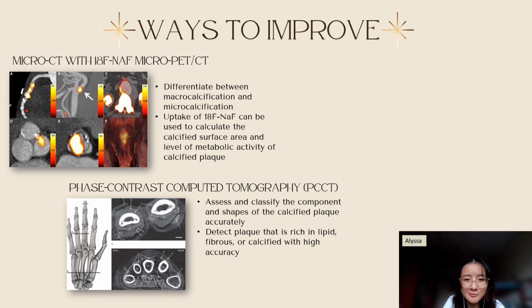Besides that, we can also use micro-CT with 18F-sodium fluoride micro-PET/CT because this method can differentiate between micro-calcification and macro-calcification. The uptake of 18F-sodium fluoride can be used to calculate the calcified surface area and level of metabolic activity of calcified plaque.